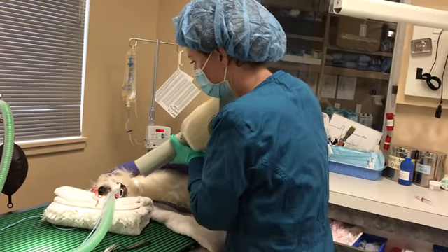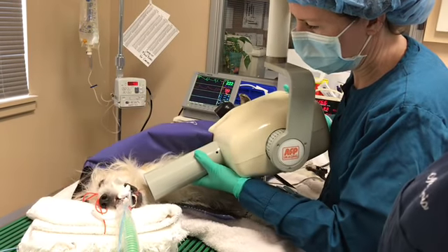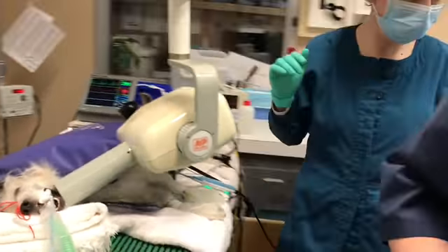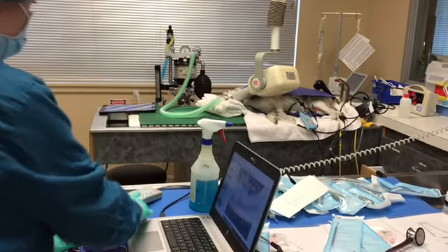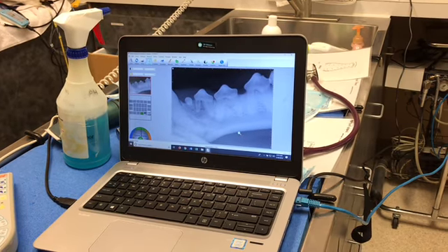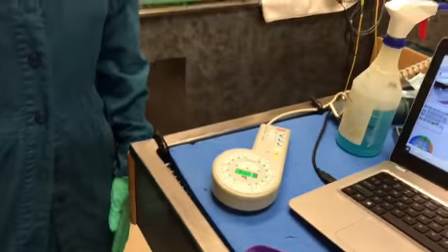Don't freak out if that pops off. Okay, everybody behind the X-ray unit. Boom! Awesome. Great. Okay, thank you.